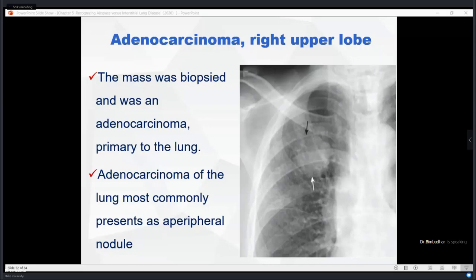In adenocarcinoma there won't be any kind of calcification, but as the disease progresses, some lung cancers also progress to calcification, but usually it is not this one. It is actually squamous cell carcinoma with cavitation. We'll talk about it, because all of them belong to the same group.